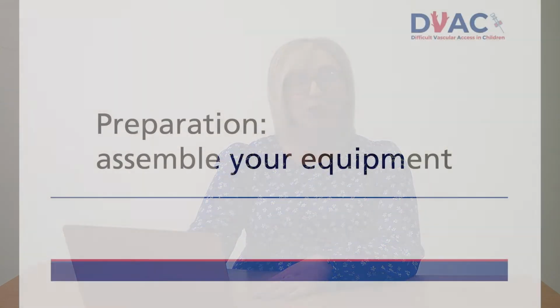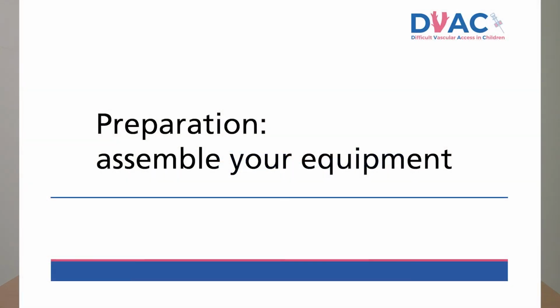Preparation. Assemble your equipment. So prior to starting out, get all the bits and pieces you need. This may sound obvious, but there's nothing worse than realising halfway through your procedure that you don't have your blood bottles or you have nothing to tape the cannula down with.